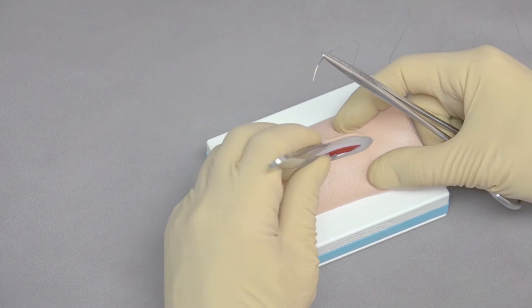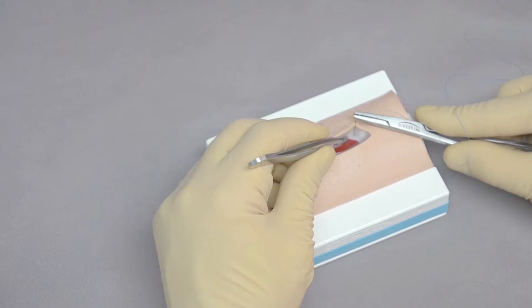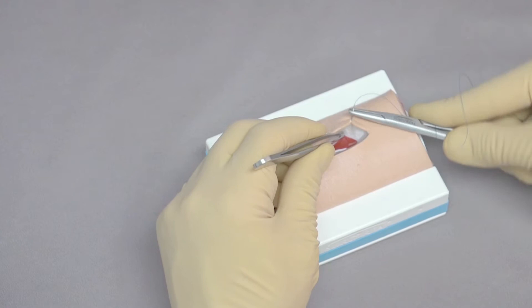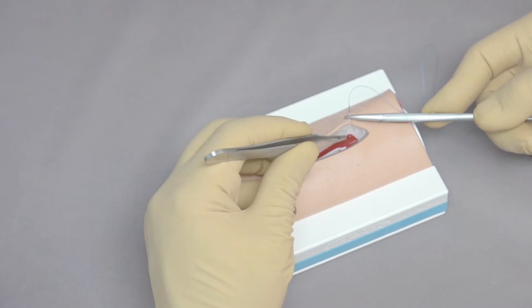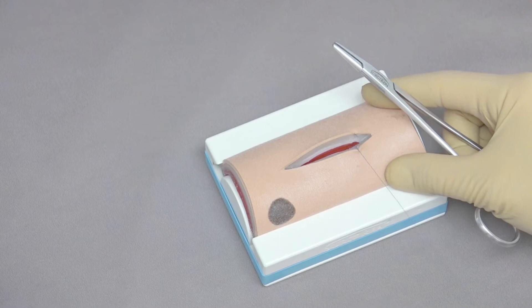We're going to use a simple continuous pattern in the fascia. Identify the fascial layer, then push back the subcutaneous tissue with the needle. Come down through the fascia, being careful to get only the fascial layer with very little muscle and very little subcutaneous tissue. Reposition the needle — you can see we're barely getting any muscle. Support the needle with the thumb forceps, reposition with the needle holders, and pull the extra suture through.